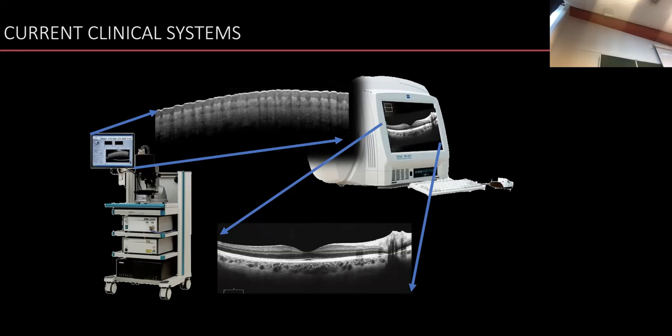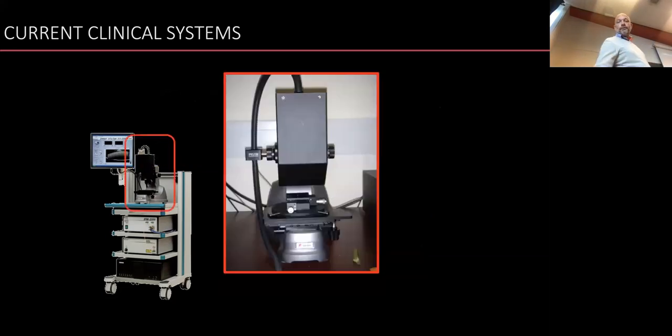And in ophthalmology, we image the back part of the eye. Cross sections like that, where we really have a full anatomy of the retina, all the layers there, and even down to what we call the blood supply of the retina, the choroid. And you can imagine that these are really big applications for OCT in the clinic, because physicians did not have the option to create those types of images before, and now they do.